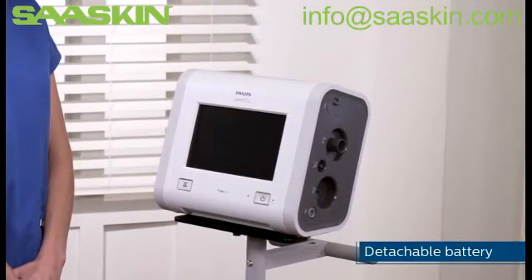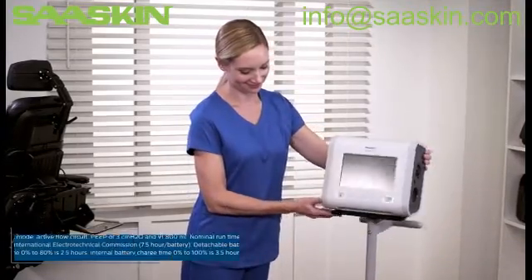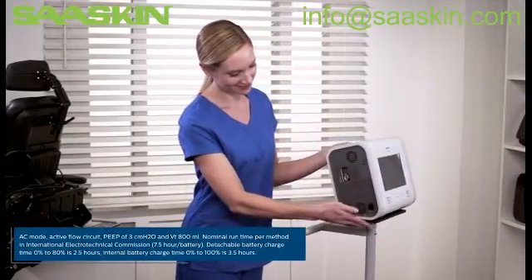The detachable battery can provide up to seven and a half hours of therapy and, when combined with the internal battery, can increase to 15 hours.